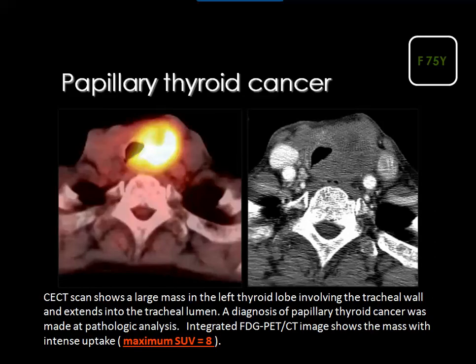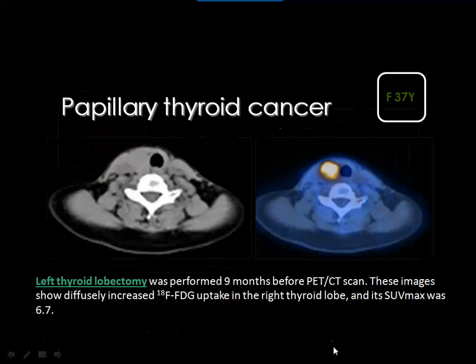You know that the role of PET scan is not well established in the diagnosis of thyroid cancer. It will show a strong uptake with increase in the standard uptake value, denoting the presence of malignant lesion. But you all know that PET scan may show increased uptake in inflammatory lesions as well. So the final diagnosis will be reached through the biopsy, which is commonly guided by ultrasound.